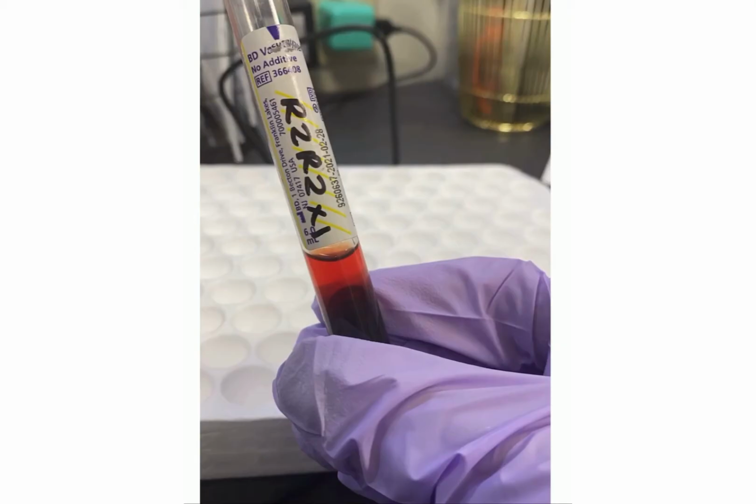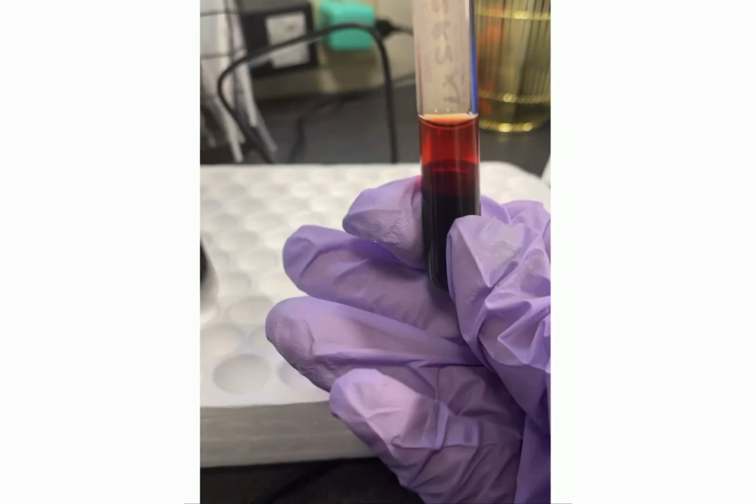Once the adsorbed plasma and donor reagent red cell mixture has incubated at room temperature, 37, or refrigerated temperatures, depending on the alloantibody or autoantibody specificity, I'll spin the cell and plasma mixture, and you'll see a delineated line of adsorbed serum plasma and donor reagent red blood cells.